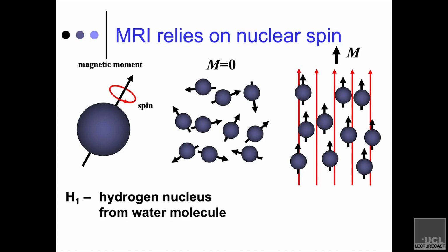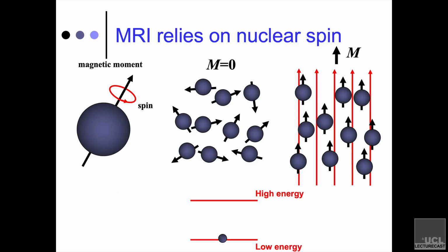Like you would be attracted to passing buses and things. Mind you, you're in a humongous magnet which would also be attracted to passing buses. So that's one of the reasons why the room is screened the way it is. And in fact, that's something we'll talk about in this week's lab about MRI safety. But at this point in time, you have a magnetic property. Your body has been magnetized.